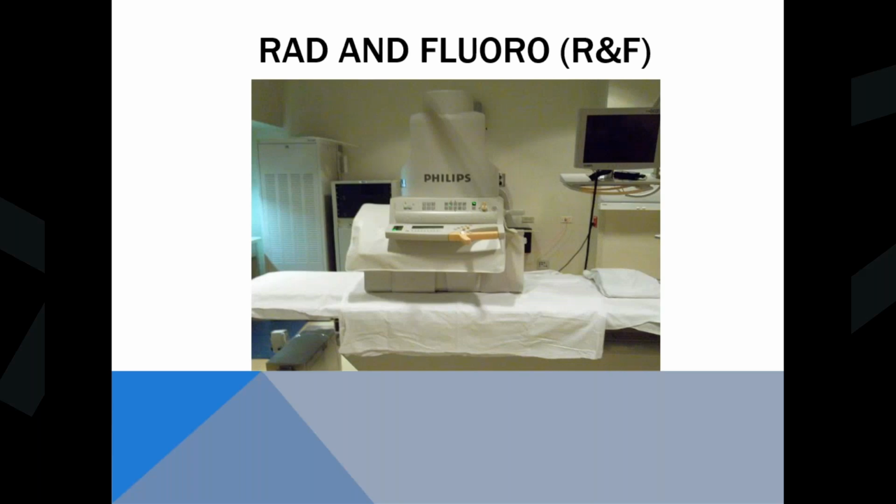This also has spot shot, fluoro and cine modes on it, so it can record a single shot, and it can record a moving shot. Typically these rooms only go up to about 12 frames per second when they're using it for cine.